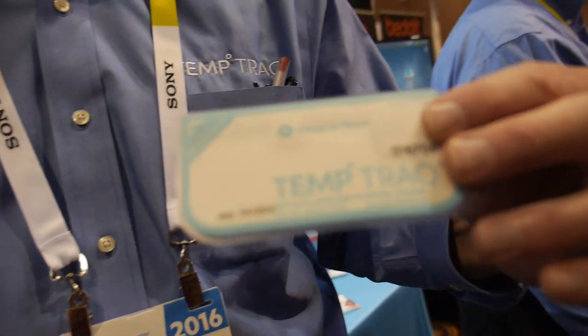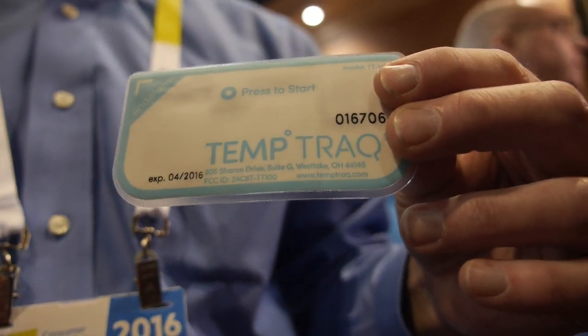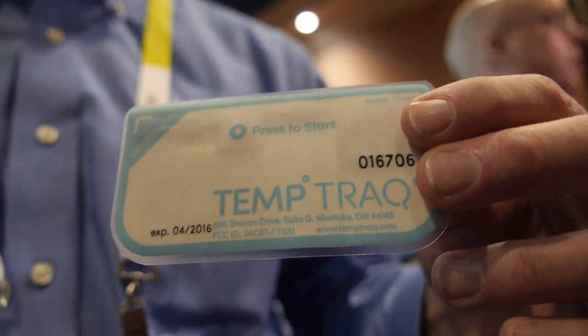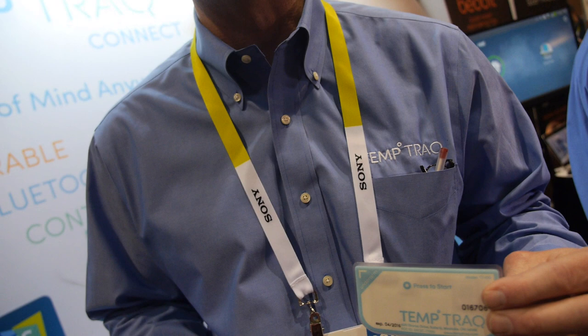And how long will it last? This is a 48-hour device. It's episodic in nature — so when your child is sick and you want to cover the length of a fever, you would put this on them and you track them during their fever. You don't recharge it? No, it's a one-time use disposable device.